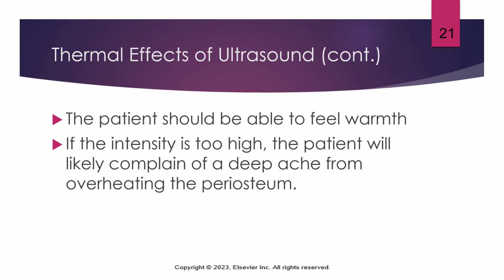So what to expect as the patient? Well, you should tell your patient that because you are using this thermal effect of ultrasound, they may feel some warmth. Now, there are some transducer heads that have a heating mode on them, so it just warms the head of the transducer.